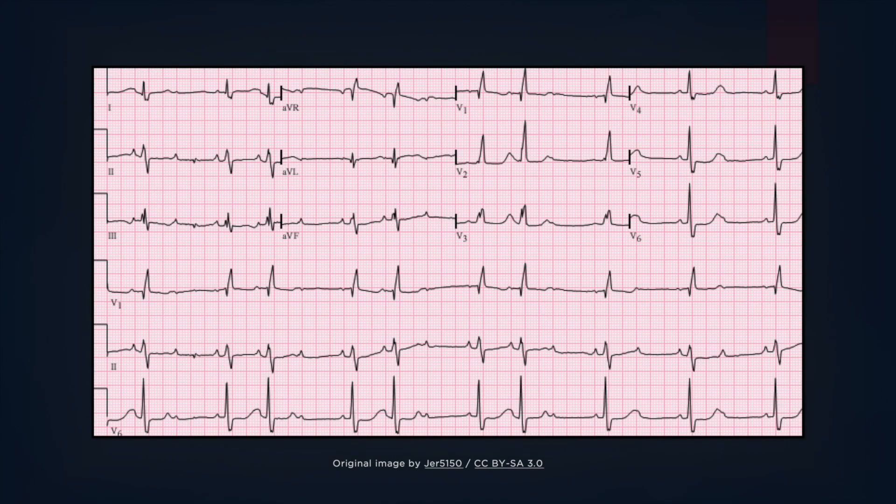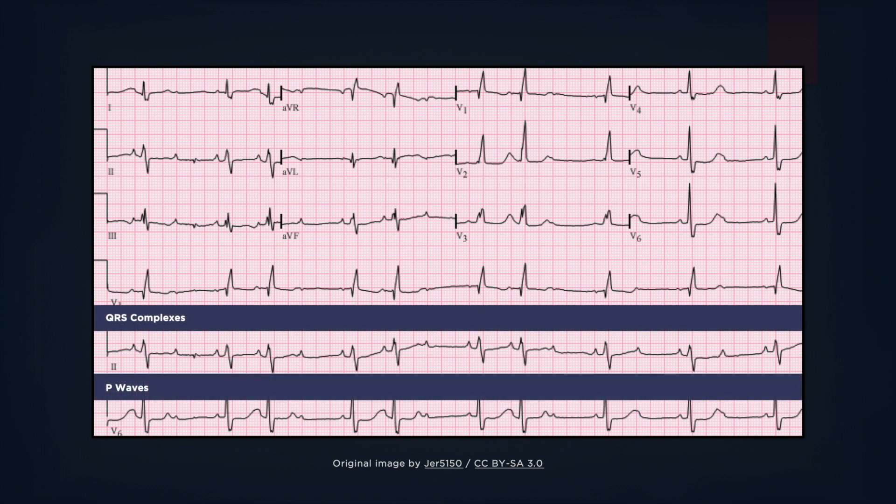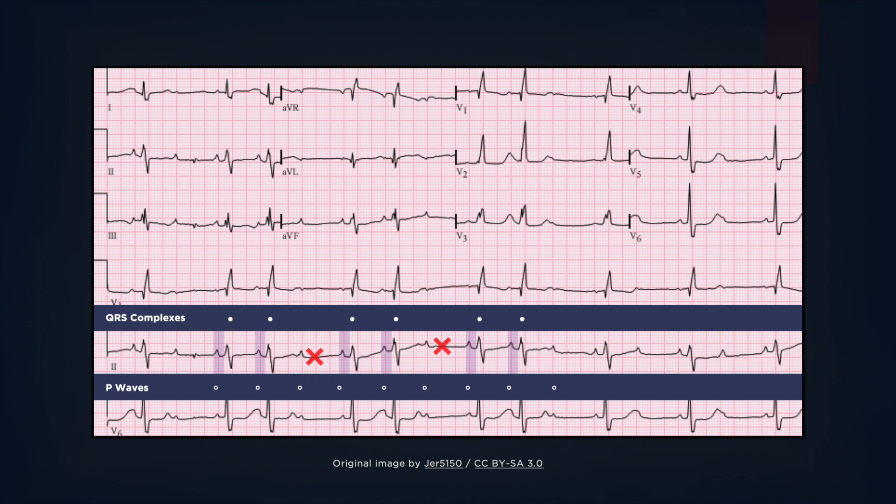Now let's take a look at this second ECG. Again, we will focus on lead 2. The PR intervals are constant, but P waves eventually fail to conduct. At the beginning of the tracing, there are groups of beats with an AV conduction ratio of 3 to 2, that is there are 3 P waves for every two QRS complexes, but near the end of the tracing, the AV conduction ratio drops to 2 to 1.